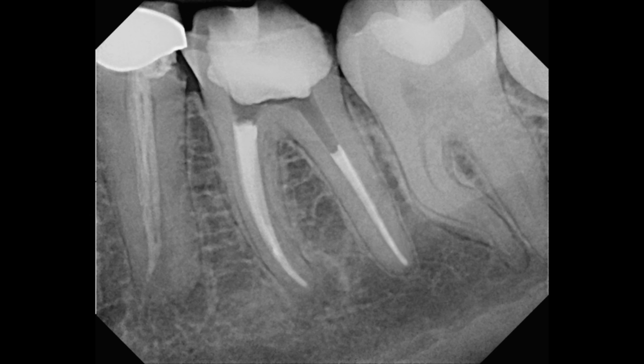In this case, we proceeded to retreat teeth 19 and 20. I retreated tooth number 19 first, followed by the treatment of tooth number 20. In this video, I'd like to demonstrate the use of the BC Sealer in conjunction with the MacPak rotary file.